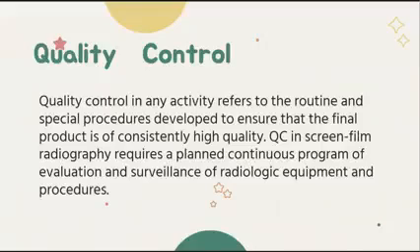Okay, so in order to maintain high quality radiographs, we conduct quality control tests in which we evaluate the capacity of the processor, of the equipment, and also check for faulty parts and replace them. Okay. When applied to automatic processing, such a program involves periodic cleaning, system maintenance, and daily monitoring. So here are some of the quality control tests done in the automatic processor.